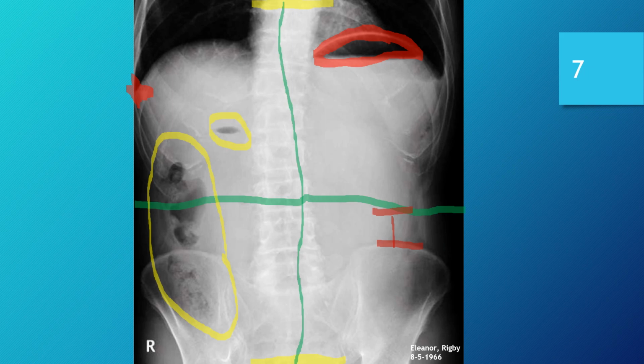On the other hand, the darkened areas in the lungs could also be an indicator that the image has been adjusted in post-processing to lighten those areas of the belly to create that look.